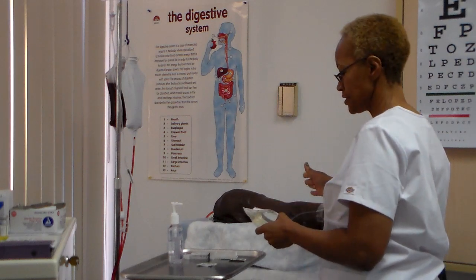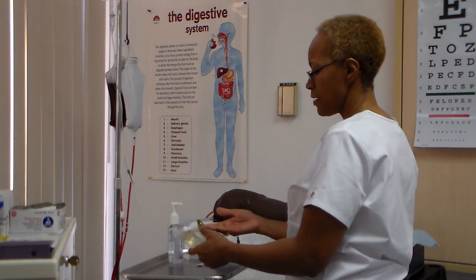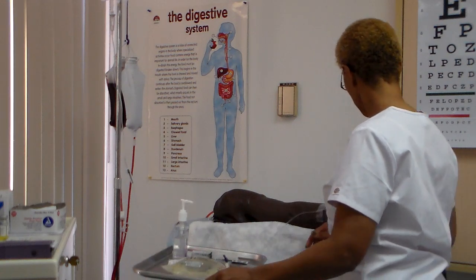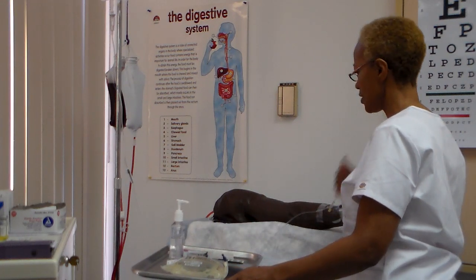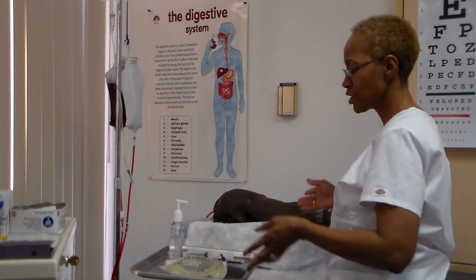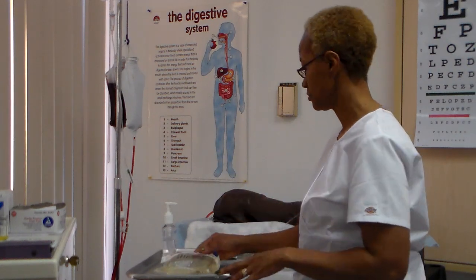Okay, so my client's already stated his name. I'll compare my medication at the bedside to my MAR again. Make sure it's the correct med and the correct patient. I've already educated my patient when I came in earlier, and I told the client what they were going to be getting, a new medication through the same line that they already have, so they know that they don't have to get stuck again. All I'm gonna do is change the bag, and they're happy about that. Okay.